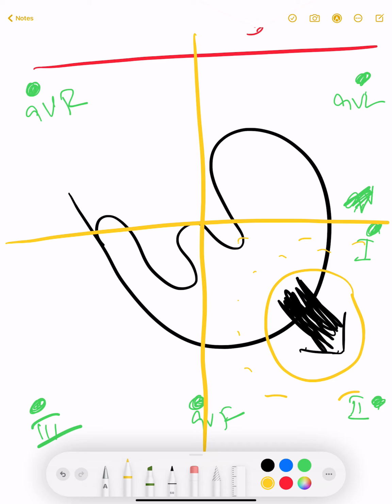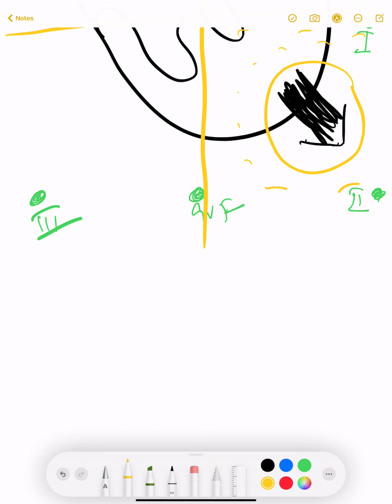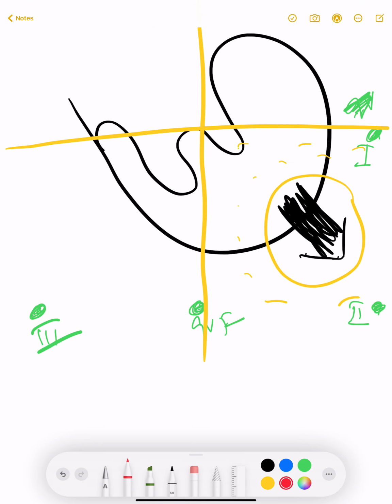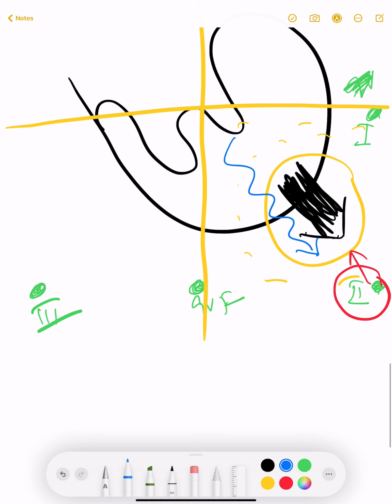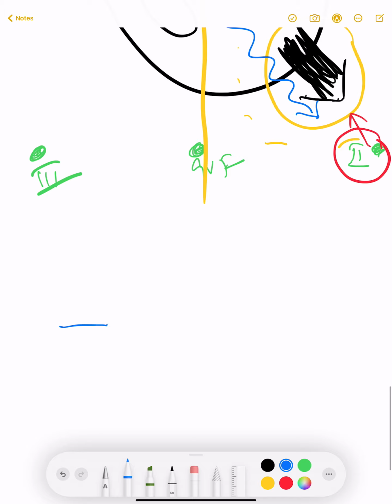As you know, these are the windows. Let's take an example. I'm sitting over here in lead 2 and I'm looking at the heart, and what will I see? I will see the cumulative current of the heart flowing toward me, toward this lead. So if the axis or the current is flowing towards the lead, what will happen? There will be a positive deflection.